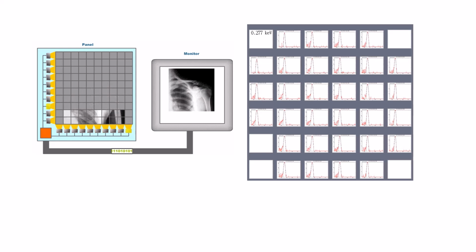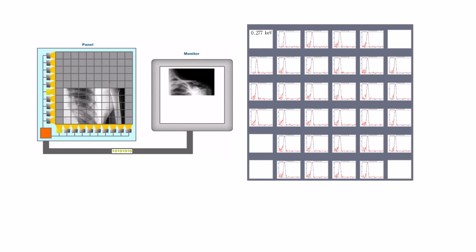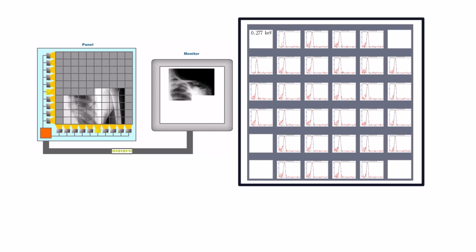The imaging receptor that we use in digital imaging is a matrix made up of detectors which detect the intensity of the X-ray in each one of the picture elements or pixels that you see. When X-rays interact with tissue, they create a density or intensity. The intensity of this interaction is recorded on the matrix.